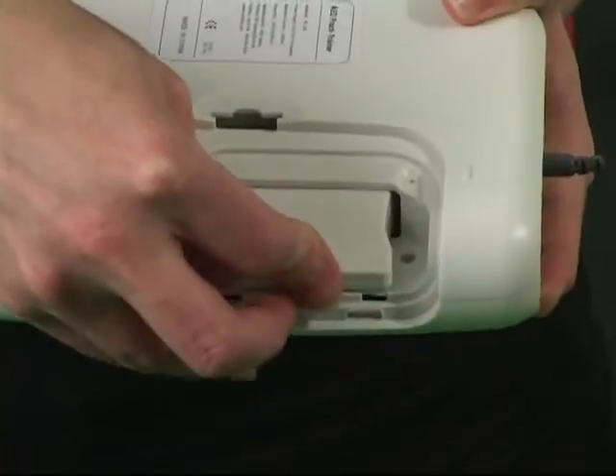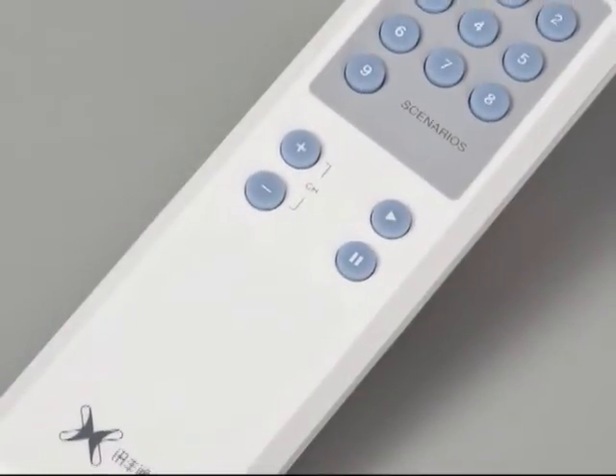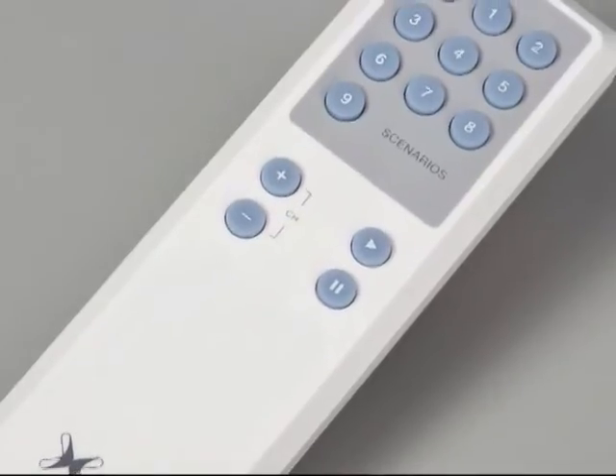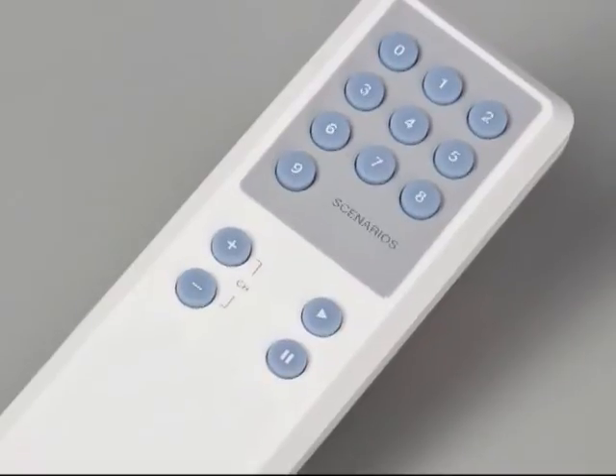If guidelines change or you want different languages, for a nominal fee you can purchase a language module and simply replace it in your device like this. The remote control allows the instructor to make changes while standing several feet away from the device as students are using it.